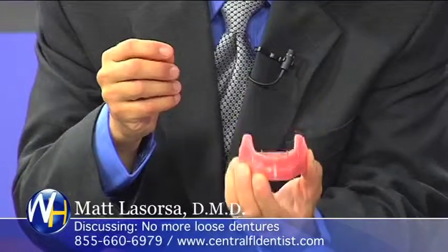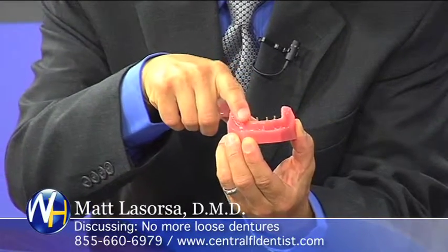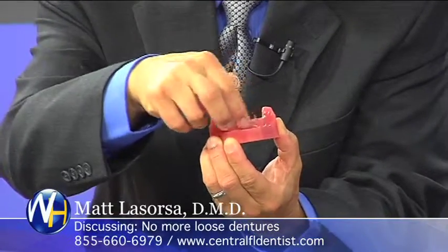Hold that up a little bit so we can get it on the camera. This is 4 mini implants on the lower arch. And this is what we typically see. This is a very atrophic mandible, meaning this patient has been wearing dentures for a long time, and there's not very much bone here.